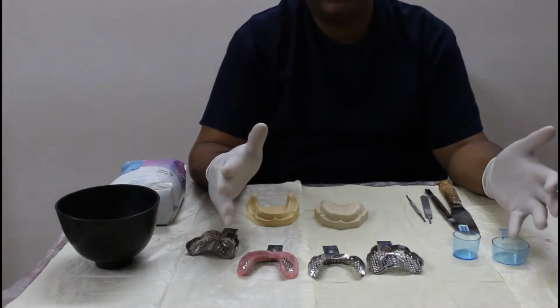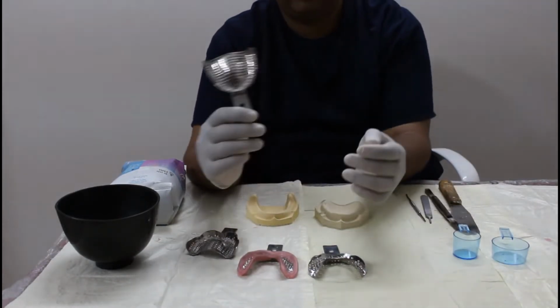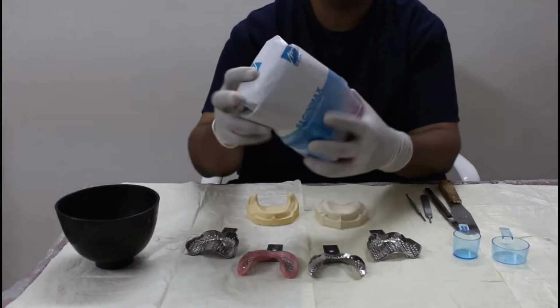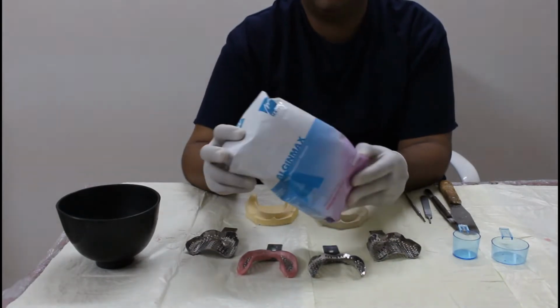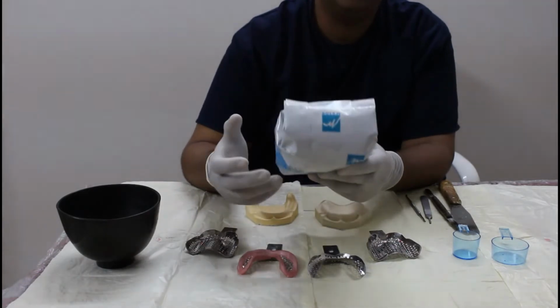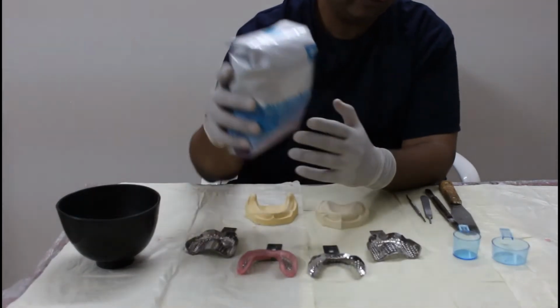Today we will make an impression with alginate. So we have perforated trays, we have a packet of alginate. It's an irreversible elastic impression material. It comes in powder form. We have to mix it with water so we get a gel form.